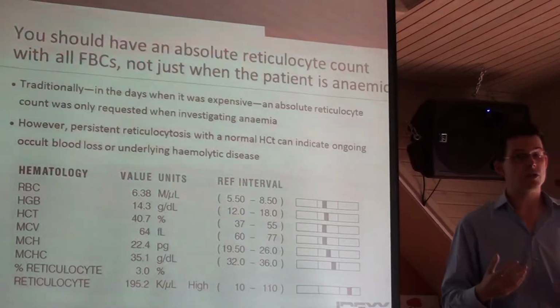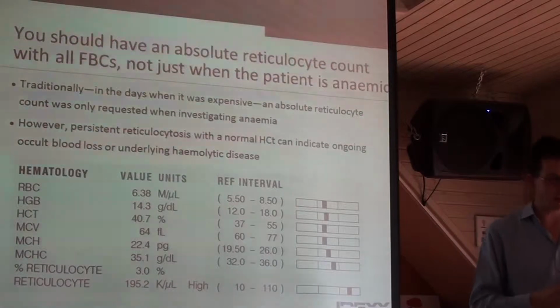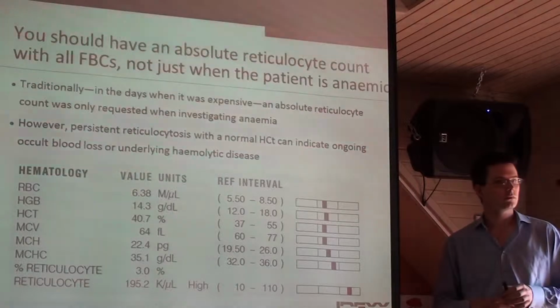Traditionally, we only looked at the reticulocyte count down a microscope. It's a very manual, labor-intensive process when we had an anemic patient.